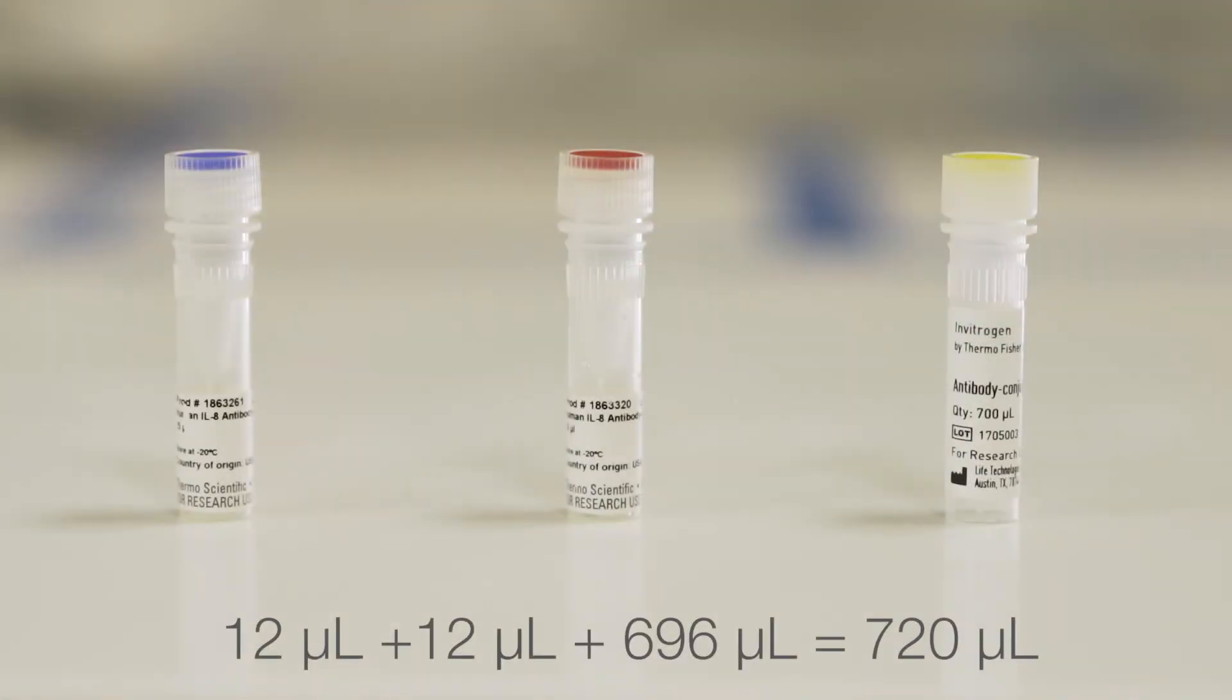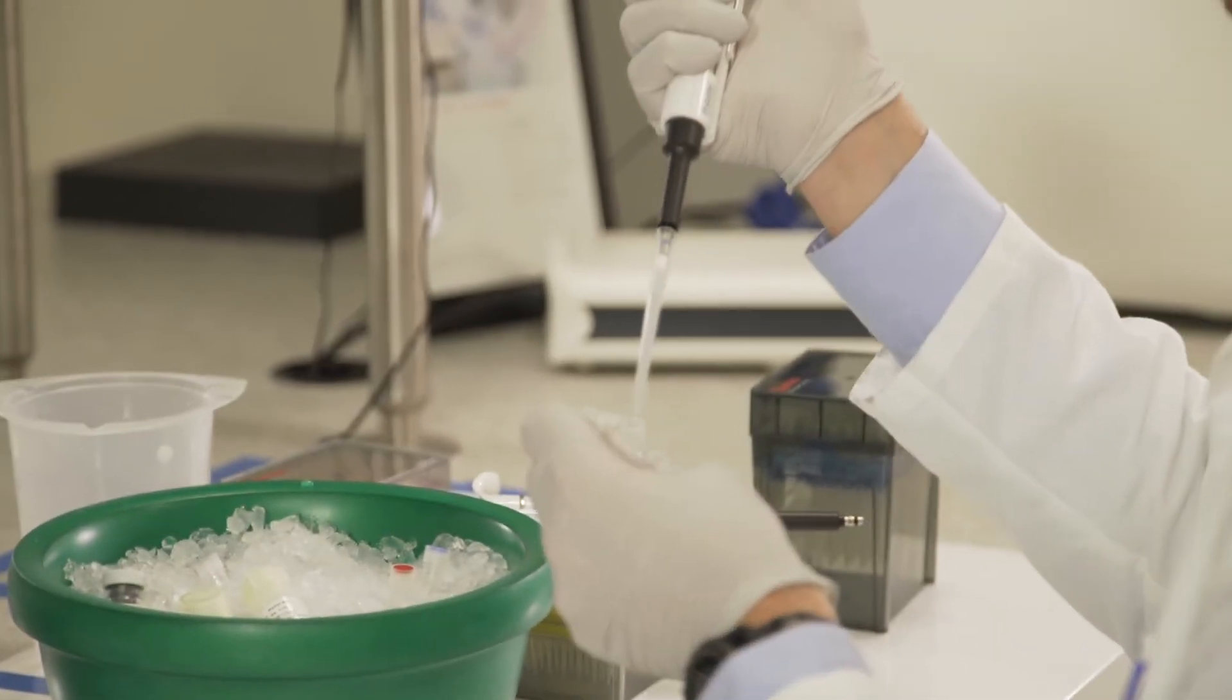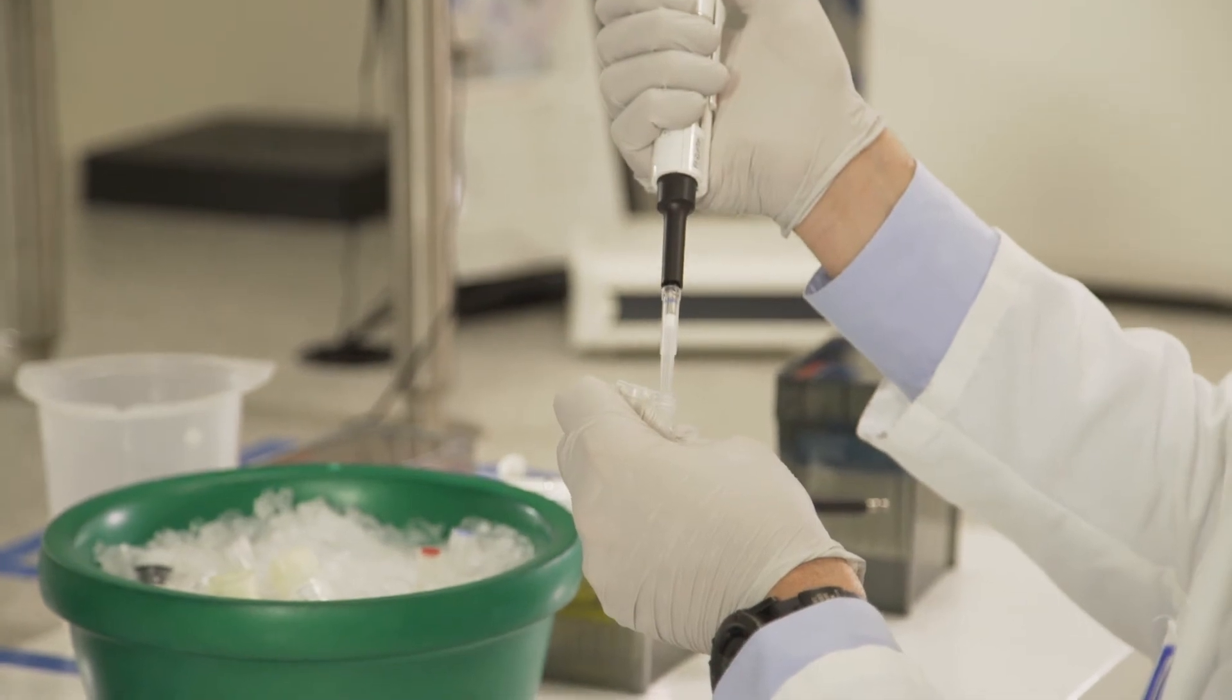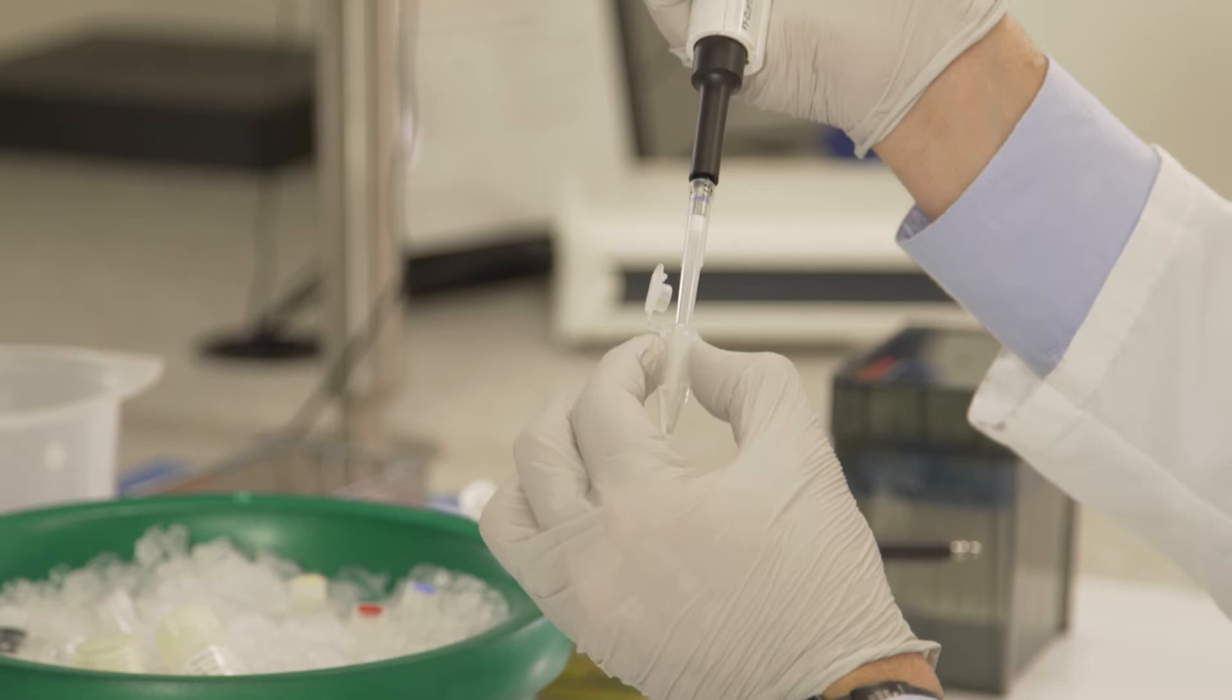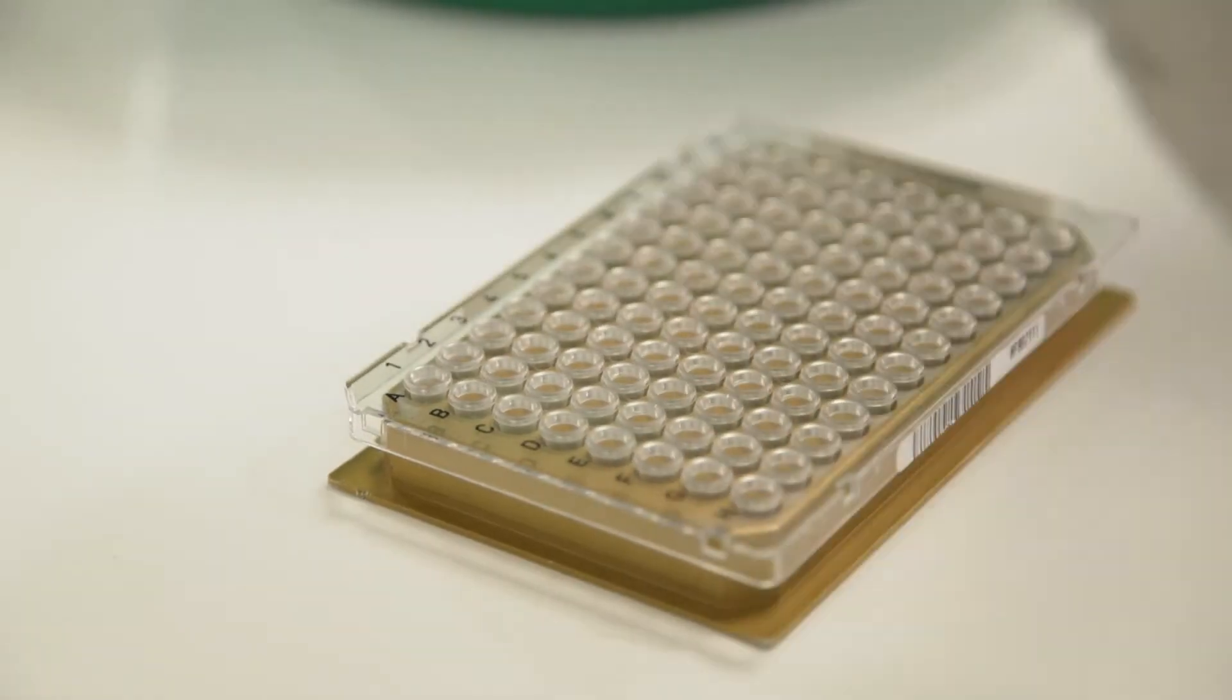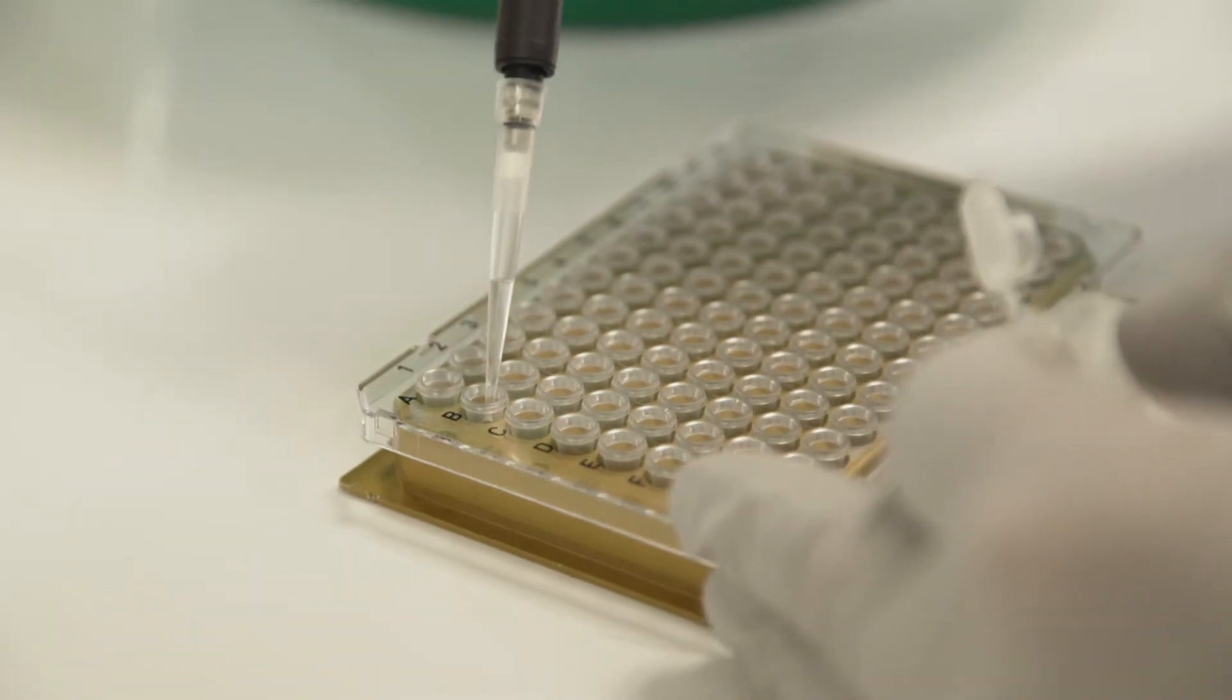During that time, create the antibody conjugate mixture by adding antibody conjugate A and B and the antibody conjugate dilution buffer in a 1.5 milliliter microcentrifuge tube and pipette up and down. Transfer 80 microliters of the antibody conjugate mixture into the designated wells of the working plate.